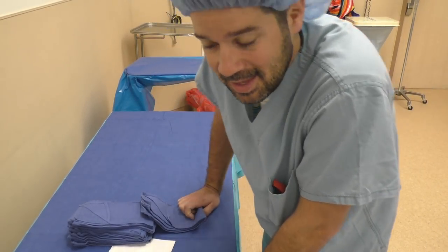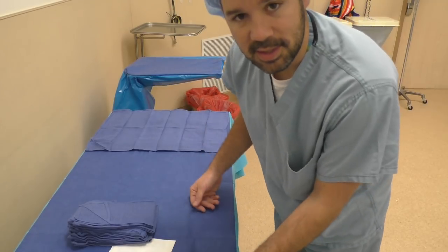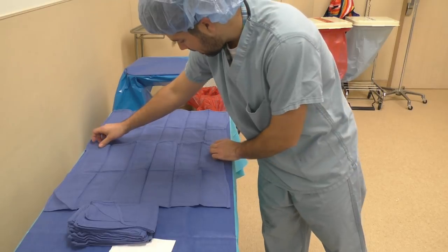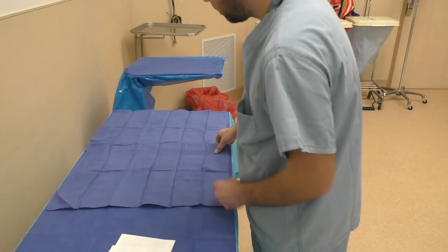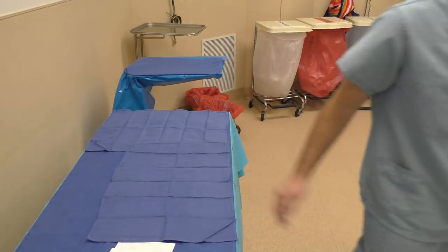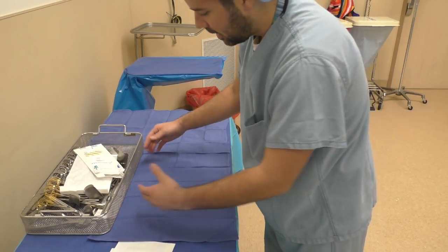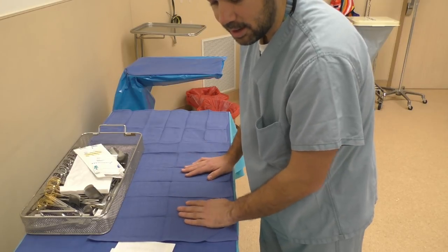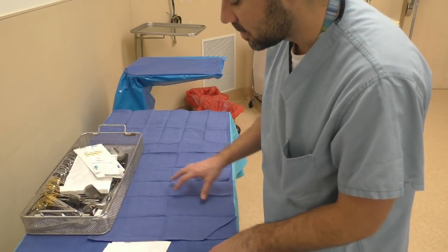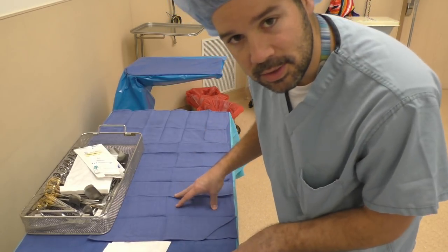First off, draping of the back table. Usually I start with my working field first — in this case my working field is going to be on the far end of the table. I'm going to start draping this way, overlapping the towels going the entire length of the table. If you have a really small case and just want to reinforce the instruments, you can set a towel lengthways, bring your instrument tray over, and all of your instruments will be reinforced by this towel. These back table drapes can be a little thin, and sharp scissors can easily puncture them, so it's important to reinforce your back table. Personally I like to use a three-quarter sheet over the whole back table, but for a small case you can just use simple towels.